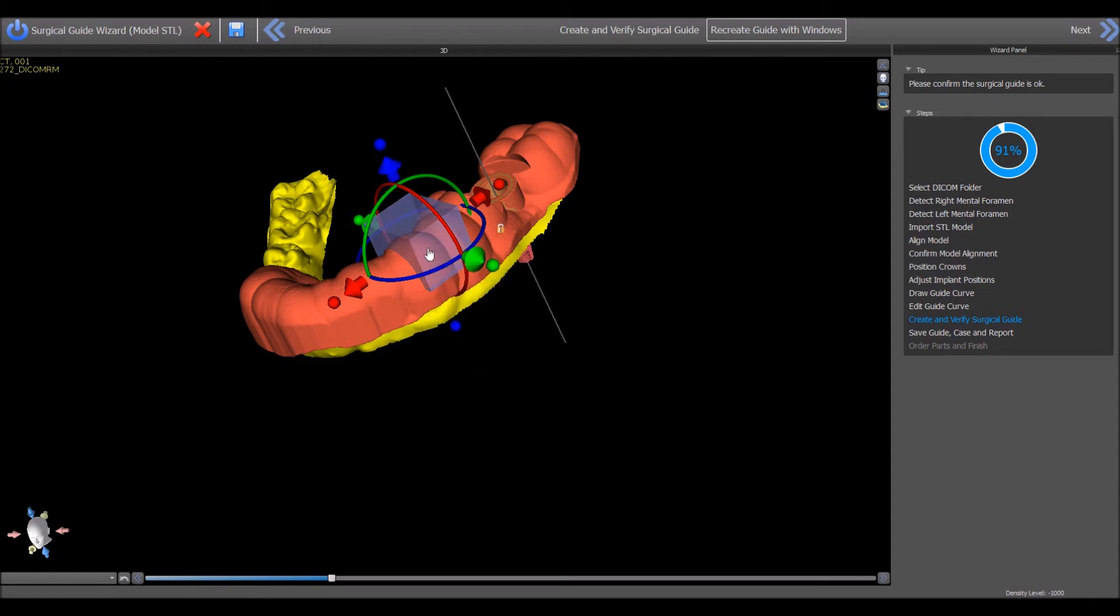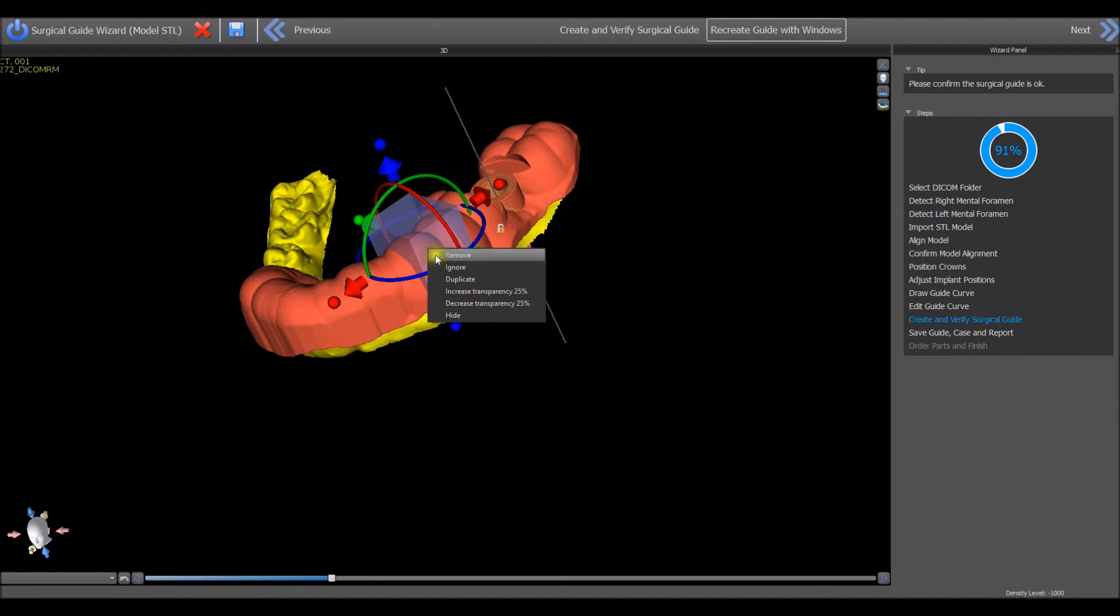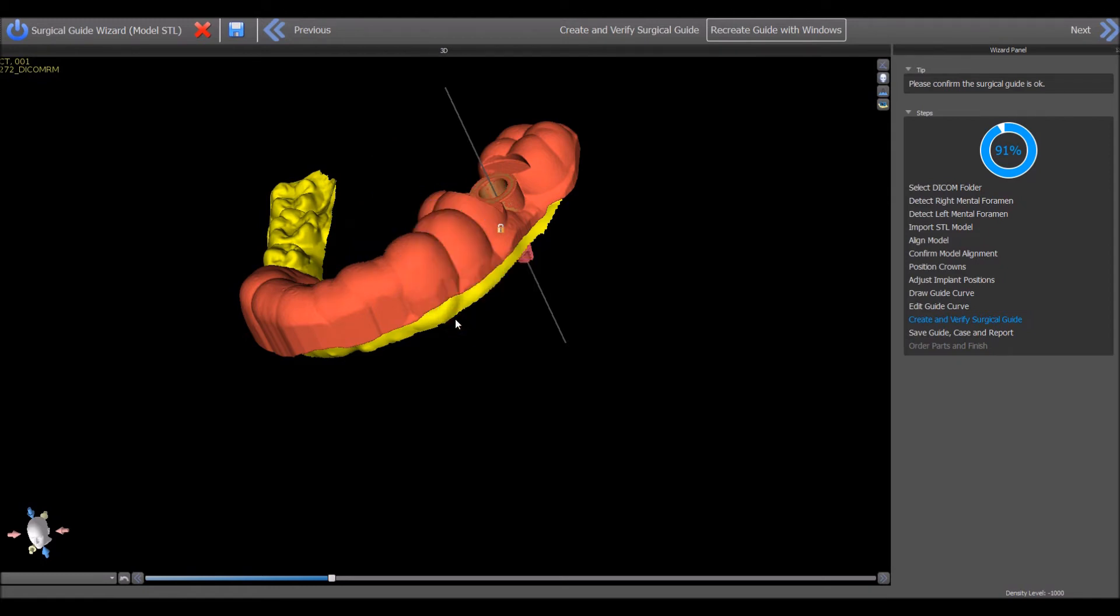Other options that are included in the menu when right clicking on the block are remove to delete the rectangle, ignore to tell the software not to use this rectangle when creating the surgical guide, or hide to temporarily hide the window.